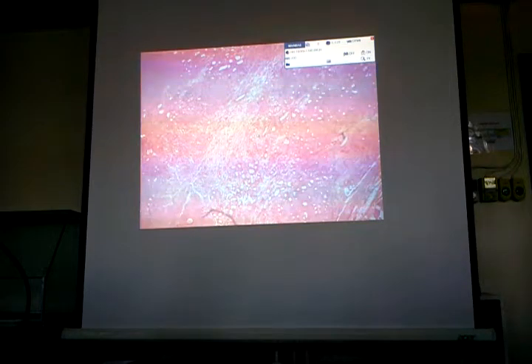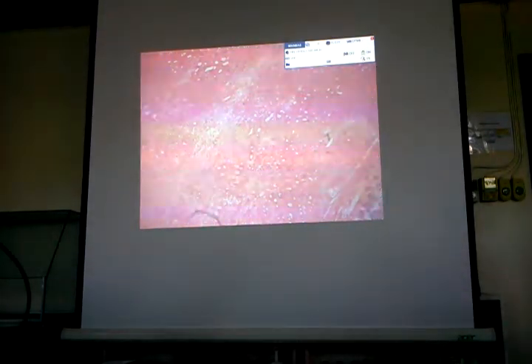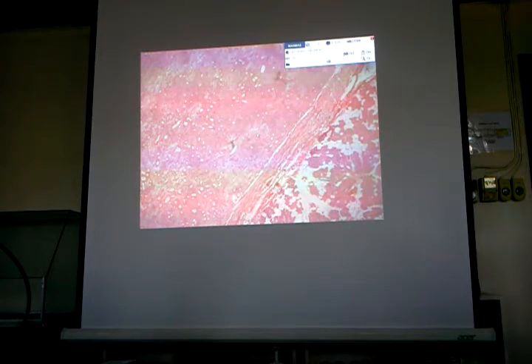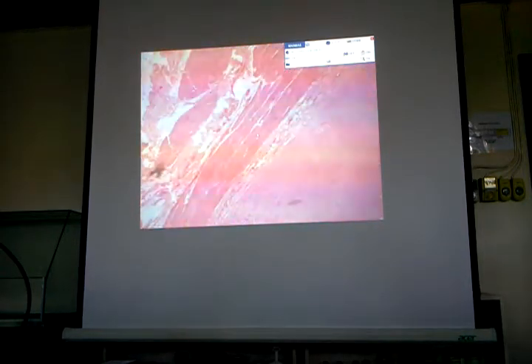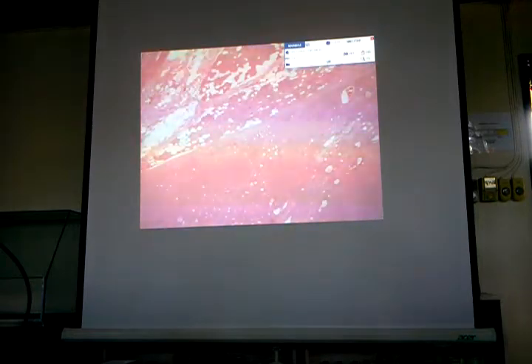However, all the tissues and all the cells that we have seen are benign, and they are separated from the regular salivary gland tissue by a dense fibrous capsule. This is a benign tumor. What is the most common location of this tumor? Which among the major salivary glands will this type of tumor develop in most of the time? Parotid, submandibular, sublingual, submaxillary.